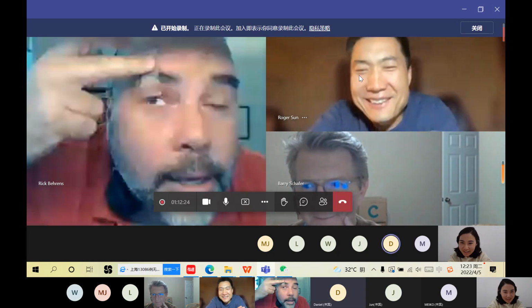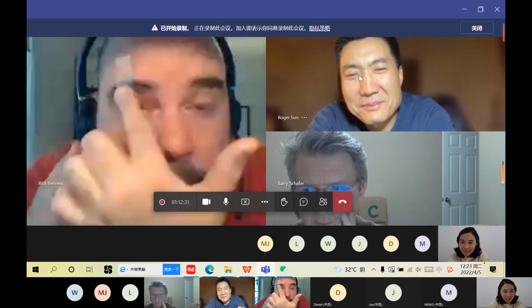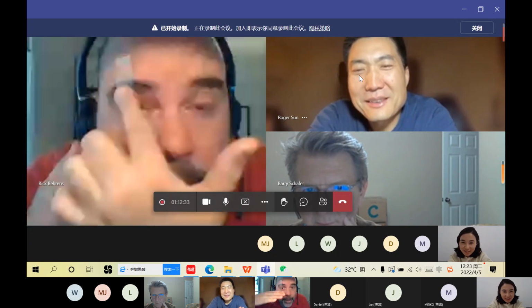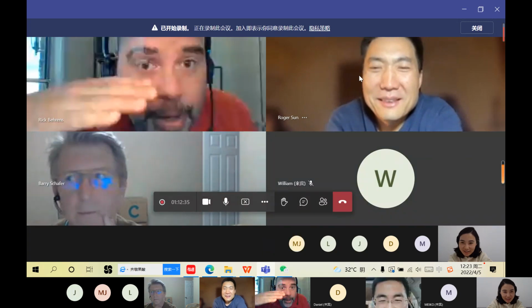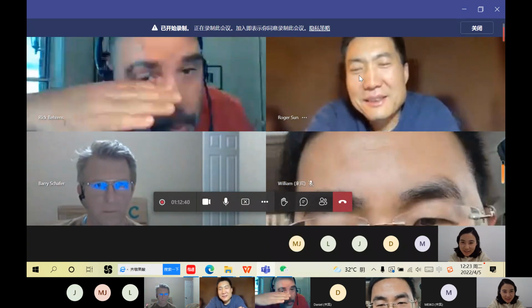So if I try to blink, I can't blink because it's all held there. And when you put the eye seal here on the bottom, you're going to approach with the eye seal, and then ask the patient to raise.